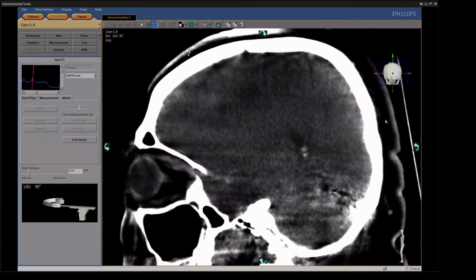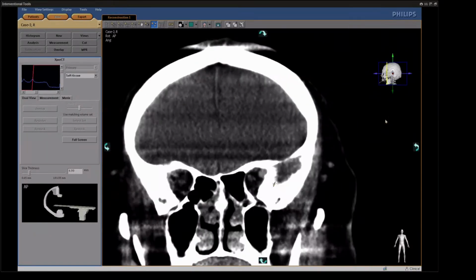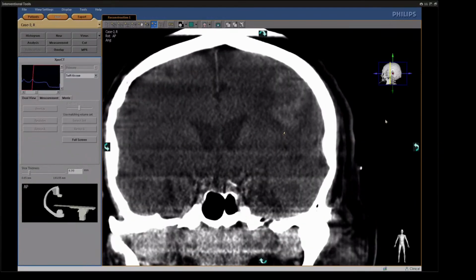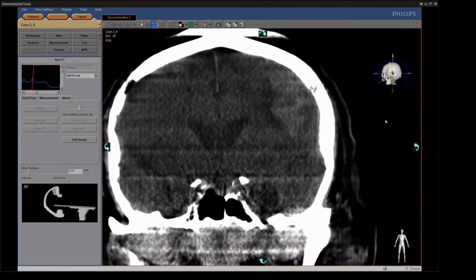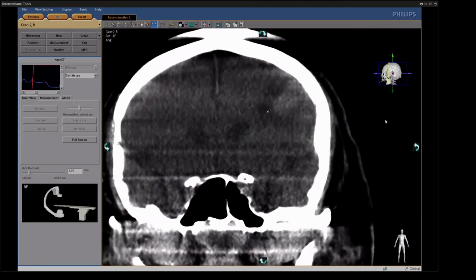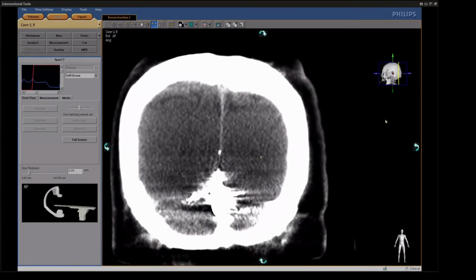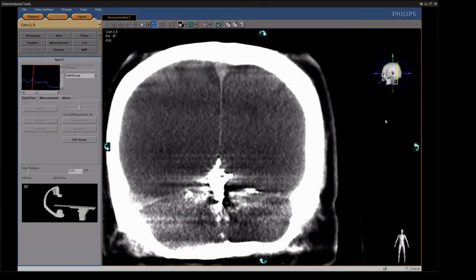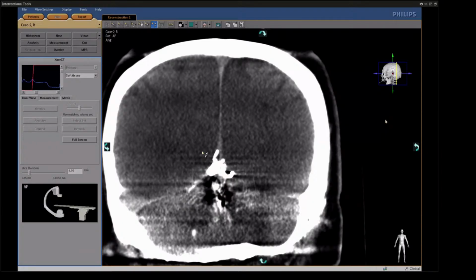Okay, let's see like this. Yes, it was. Ah, no, it wasn't operation. It was an ischemic stroke on the left hemisphere, and I think at that time angiography was done, and this pathology was diagnosed. The stroke was in December. Okay, but there is no source for the ischemic stroke from the arterial side. Okay, let's check it again.